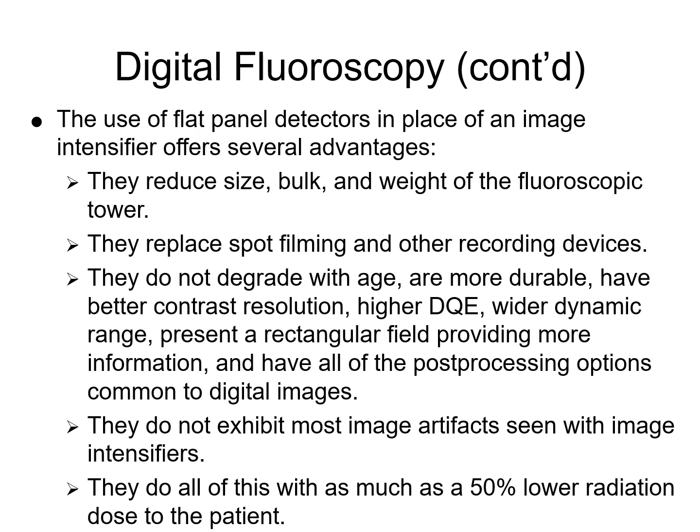Higher detective quantum efficiency. Again, I mentioned that previously. I talked about what DQE was. With our flat panel arrays, the indirect ones pull about 60% of the remnant beam and capture it. So that amorphous selenium is a little bit lower. It's somewhere in the mid-40s, I think, but it's still higher than screen film technology or conventional image intensifier.